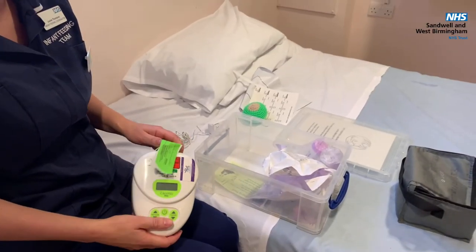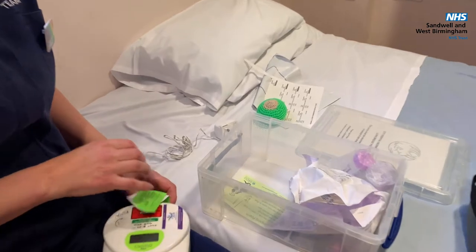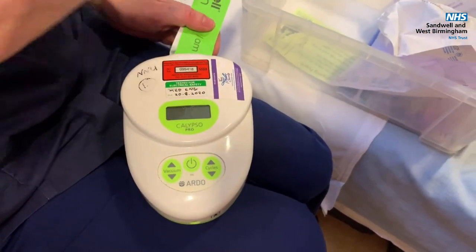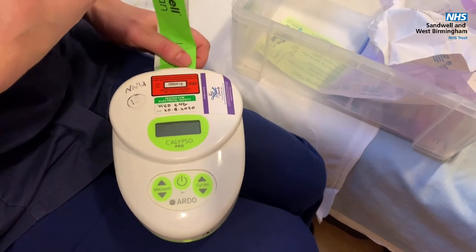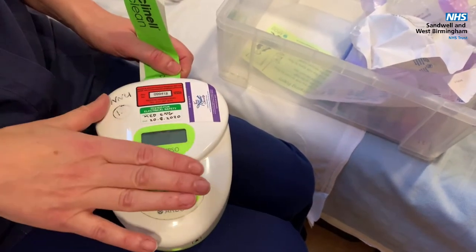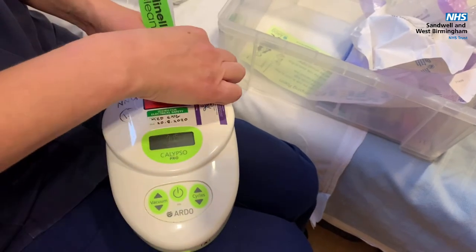So this is your breast pump. These are just small breast pumps that we loan out to parents. We've got hospital grade, stronger breast pumps to use on the unit, so while you're on the neonatal unit use the hospital grade pumps. When you're at home or out and about, you can use these breast pumps.